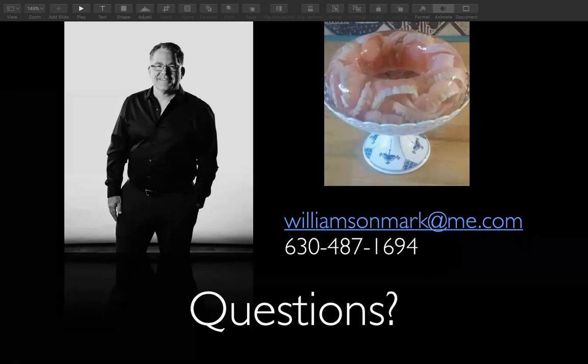I wouldn't do 3. Now, if you want to do 3, Nobel has the trefoil version. I believe that's just for the lower. But if you want to do a 3 implant type of thing, that's something that they do have. Like I said, if you go to Nobel's website or you Google it, they'll have all the data you want that shows that cross-arch stabilization, splinting them together the day of surgery, that's what's recommended. So I hope I answered that correctly for you.